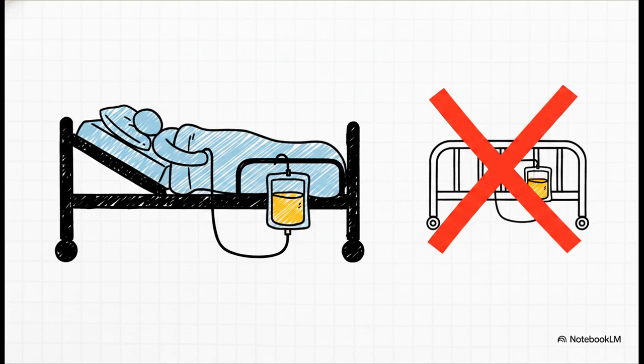Okay, the catheter is in, but hey, our job is definitely not done yet. Once it's inserted, the basic physics of our drainage system take over and become paramount. You absolutely must hang that drainage bag below the level of the bladder. Why? To maintain gravity flow and stop any of that stagnant urine from flowing backward and causing a massive contamination issue. Also, secure it to the bed frame. Never, ever clip it to the side rails. Moving side rails up and down can suddenly yank the catheter, leading to highly traumatic accidental dislodgement.